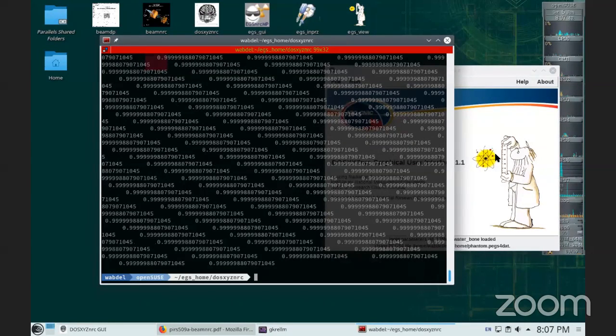Personally, I think it's tough, because if you want to do heterogeneity corrections, you need to have information about your beam itself, for example, the MLC shapes and so on. So usually you want to calculate with the 3D CT, based on your beam, your actual treatment plan.